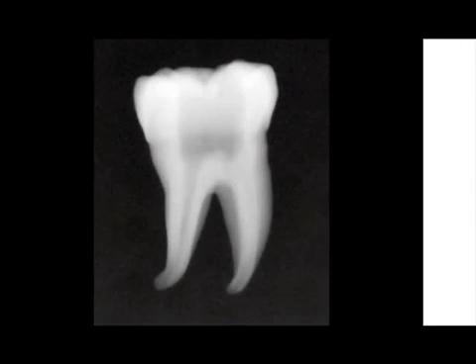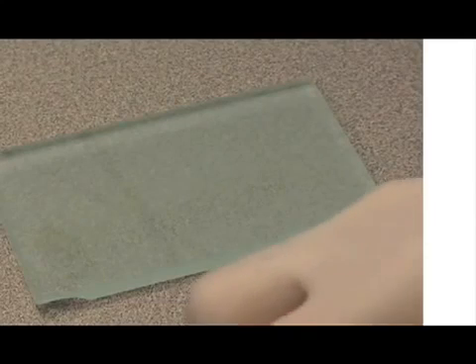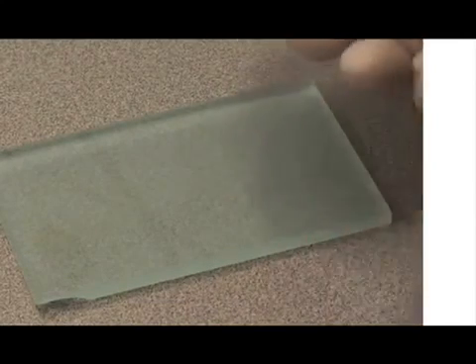We are going to show two different epoxy cement preparations in the obturation of a mandibular molar and a maxillary bicuspid. Here the canals have been shaped and the medium gutta percha points are trial seated in the canals. They all have significant tugback. To make a video tape, I am showing you a precise sequence that can be repeated over and over again.